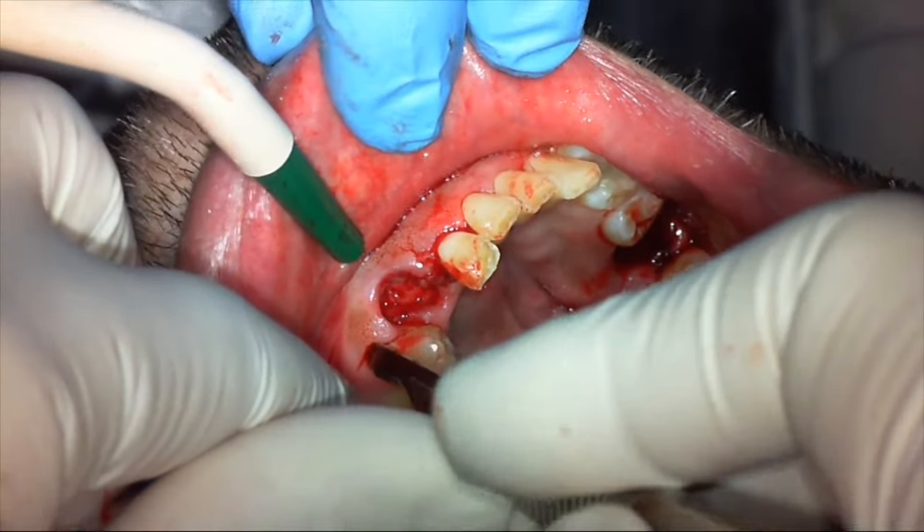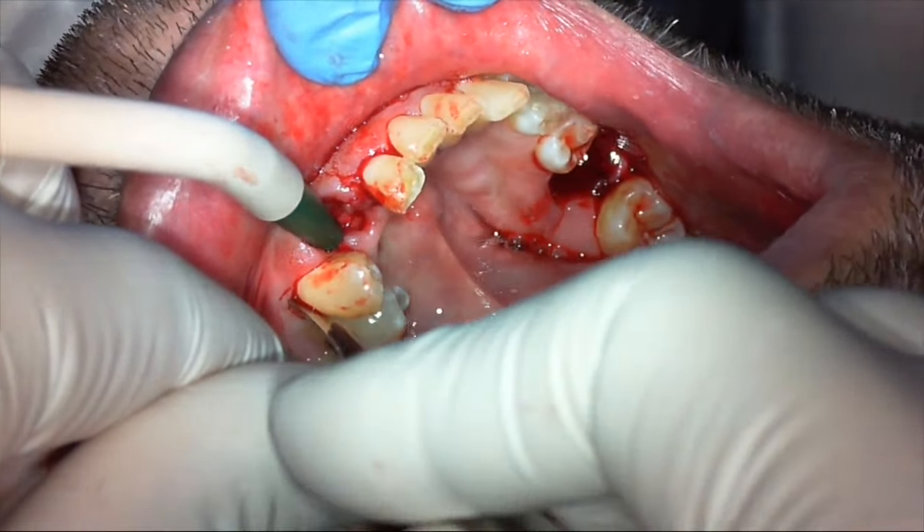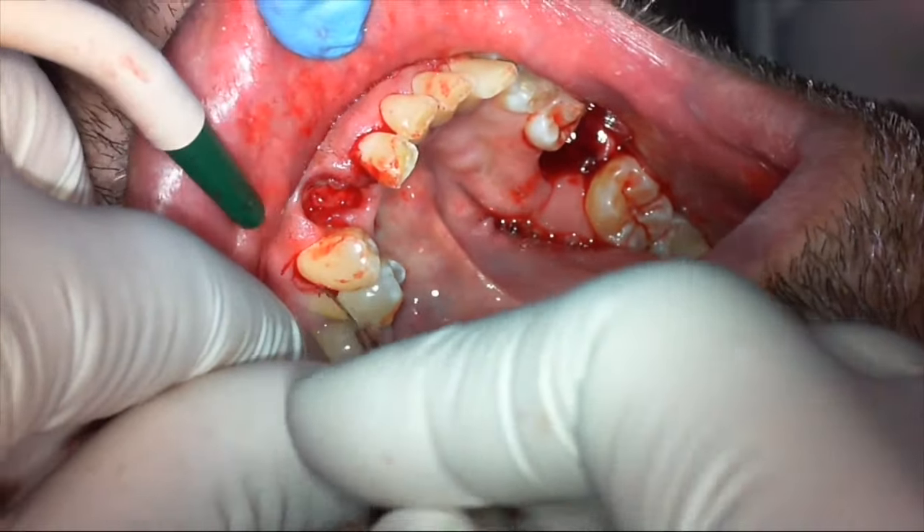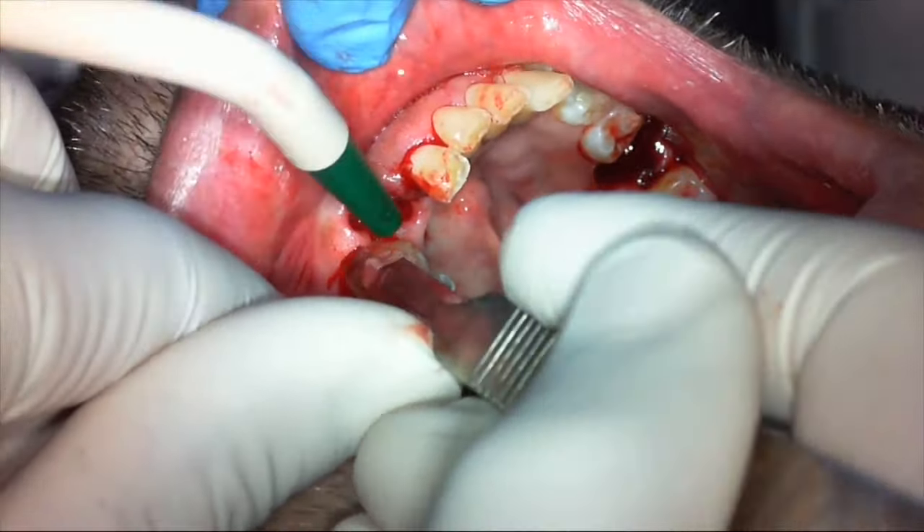We'll probably do a small vertical incision on the lower lateral position — avoid any vertical incision on the four, five, or premolar position, just to avoid cutting through the mental nerve.